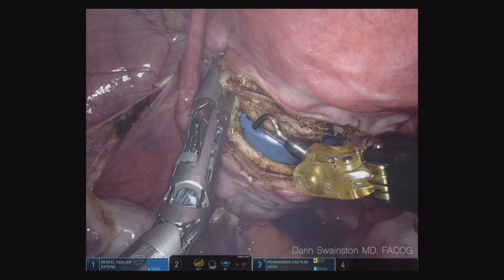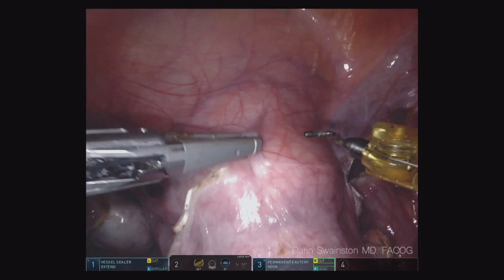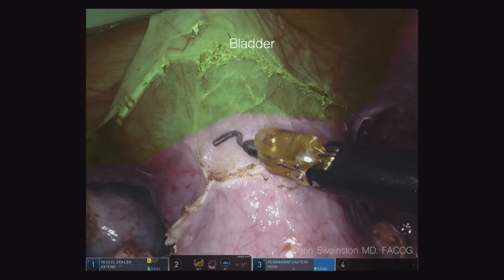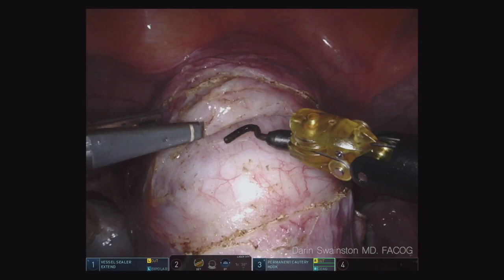Now we can pull the uterus down. I always like to backfill — I don't care how easy the hysterectomy is, I backfill. You'll see the bladder backfilling right now. I use a technique where we use the Foley sterile on the field and we use the Stryker suction irrigator — we just hook it up to it. I have them fill it until I feel like I've got enough, and then as soon as the bladder is in a good spot, I'll say drain that, and there's suction to bring it right back down. It doesn't cost me any additional time and it makes me so much more efficient and safe while I dissect the bladder off the colpotomy ring.